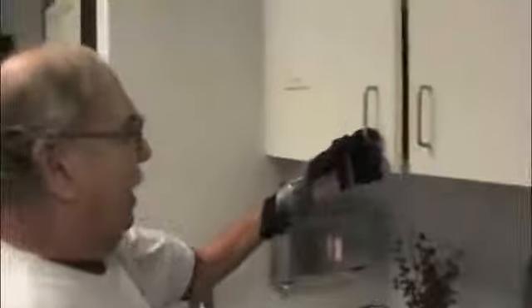Here we have the same client failing to open the cabinet due to limited wrist extension. With the SABO Glove properly positioning his hand, he is able to gain independence and achieve the task.